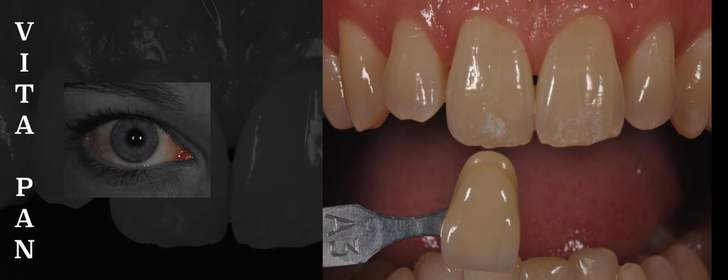Now, you select the tab and compare it to the tooth. Here is where many dentists make a mistake. Look at the photo and tell me, which portion of the tab am I using to try to select the shade? Is this correct? No, it's not. You can see that the saturated portion of the tab will give us a false negative because it seems darker than the tooth.